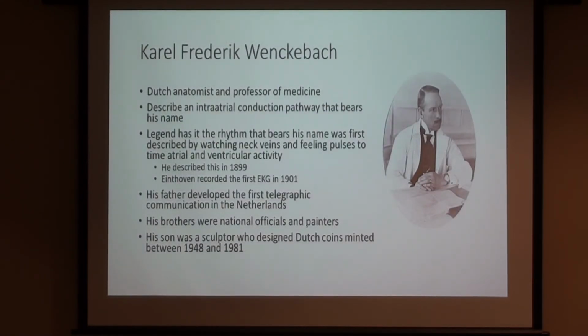Now I have to tell you about this guy. So you're going to get the history lesson. I'm sorry, forgive me. So he's a Dutch anatomist, professor of medicine. He described an intra-atrial conduction pathway that bears his name as well. Legend has it that he determined this rhythm, Wenckebach block rhythm, by watching the jugular venous pulsations to determine when the atria were contracting and feeling the pulse simultaneously. And he could tell that the PR interval, if you will, was lengthening and then dropped by doing a physical exam.